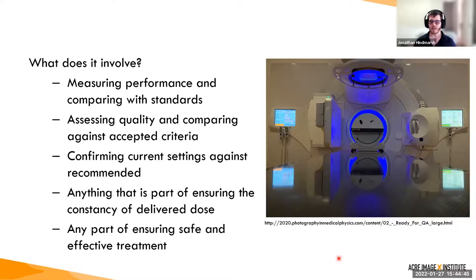Anything, any activity or component that is part of ensuring we have a consistently delivered dose, so that for our treatment, our measured unit, we know what our one delivery unit is. So we will typically talk in terms of monitor units on a radiation therapy plan. And we know a monitor unit is 1 centigray under very specific reference conditions. And the treatment planning system is able to convert that for each patient, but we need to measure that and confirm on a regular basis that 1 MU is 1 centigray under those conditions. And it's also any part of ensuring safe and effective treatment.